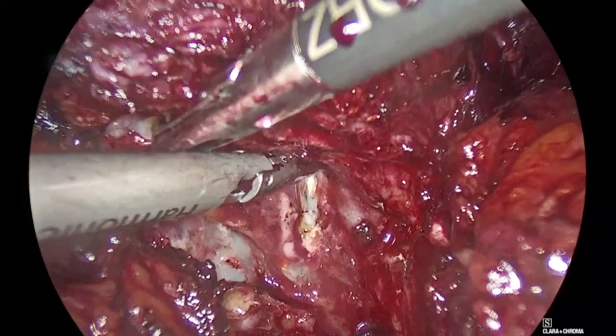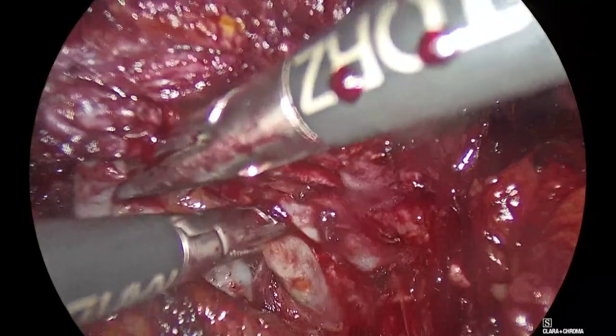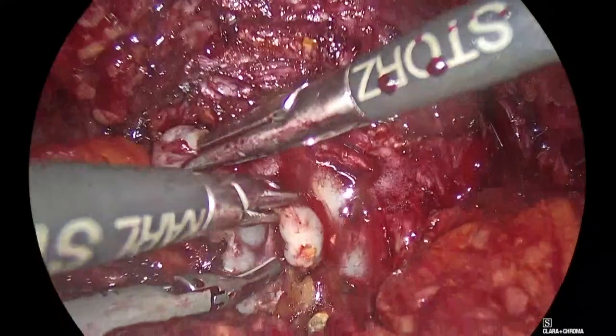This is the other vas here. Come closer, Panayotis. Suction down, towards me, so you can take this fat out. Go back, Padeli. Good. Correct. Aspirate, please. Good. Very good.